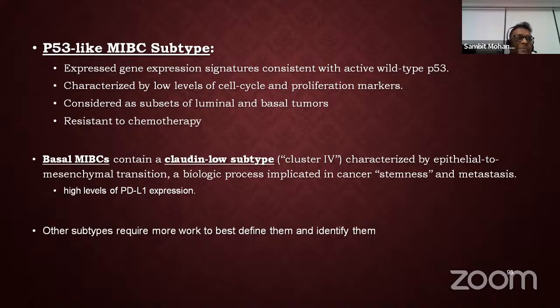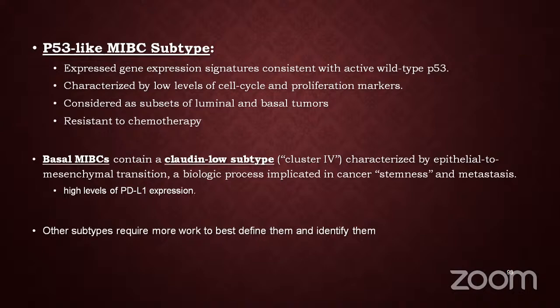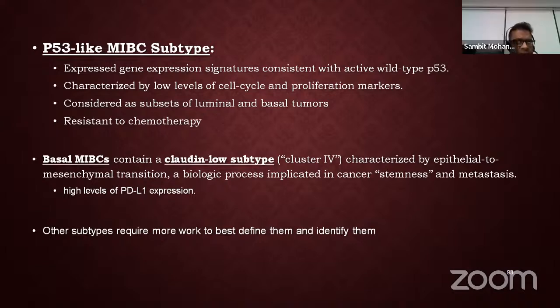I write high grade muscle invasive carcinoma with extensive squamous differentiation, comma, see comment. In the comment, I write that the majority of squamous cell carcinomas of the bladder are extensive squamous differentiation in a conventional high grade urothelial carcinoma, and a minor subset of pure squamous cell carcinoma exists. In that way, I just phrase it.